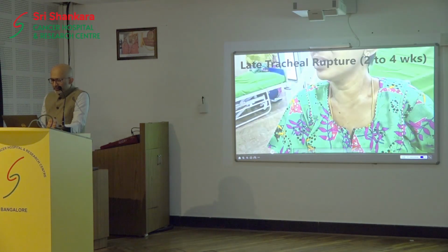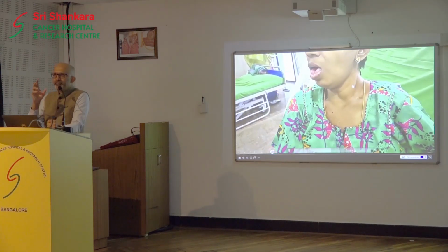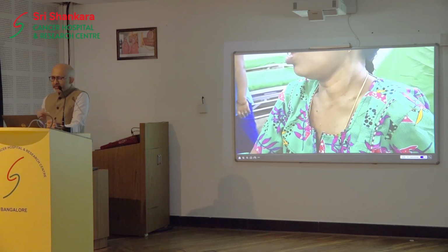So, what other things? This is not because I go around training a lot of people. This is from one of the people whom I trained. So he shared this video after 2 weeks. So this is what was happening. She had undergone a delayed tracheal injury, probably because of bipolar usage or whatever. But luckily, this patient didn't need any exploration or resurgery. It resolved in 2 weeks.